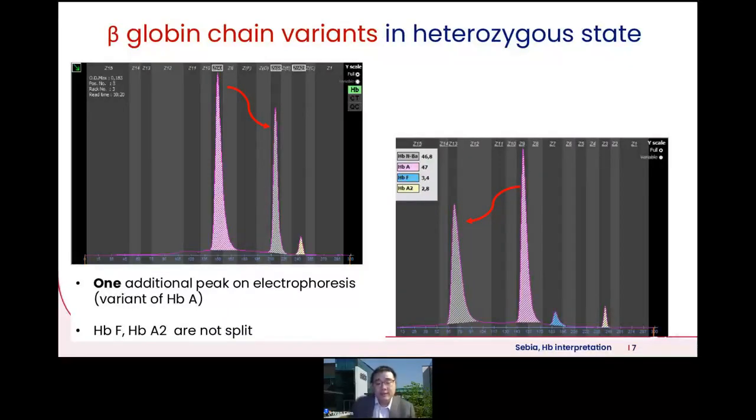It's also almost always the case that the hemoglobin beta variant peak would have a lower percentage than that of hemoglobin A. One good way to remember this would be that because the hemoglobin variant that's being formed would be less stable, so likely its composition in the blood will be reduced as well. Okay. And in the instances of the beta variant, it's important to note that the hemoglobin F and hemoglobin A2 peaks, the minor fractions, are not split. Why? Because the beta gene is only present in hemoglobin A, so you do not split the other hemoglobins. All right, this is the distinct signature profile of the beta globin variants.